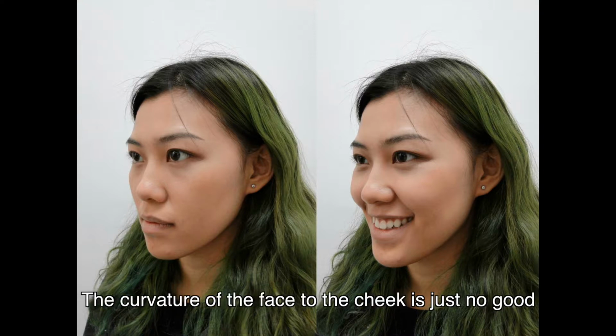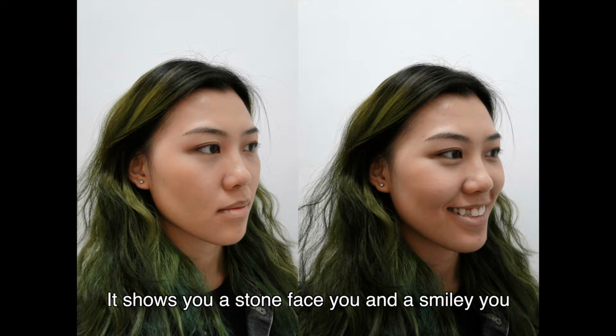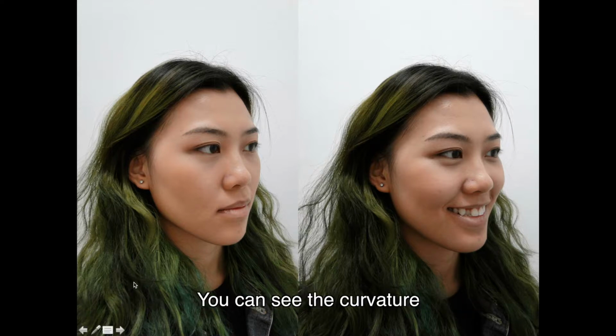The curvature of the face, the cheek, is just not good. The cheek and then the chin, the curvature of the cheek brings out when you smile. Next. See, this is another picture. It shows you a stone face you and a smiley you. You can see the curvature. What about the teeth? Yeah, okay, you have a crossbite.